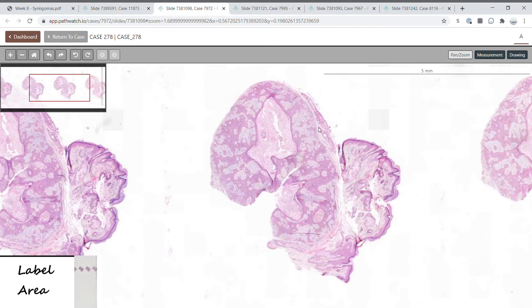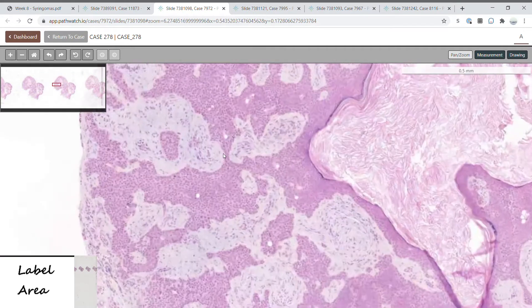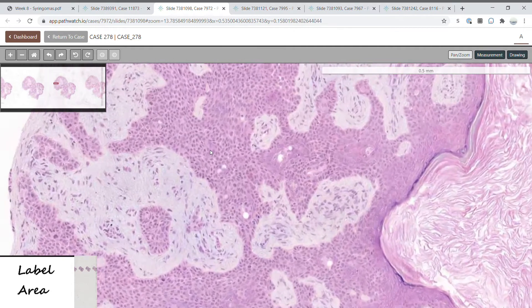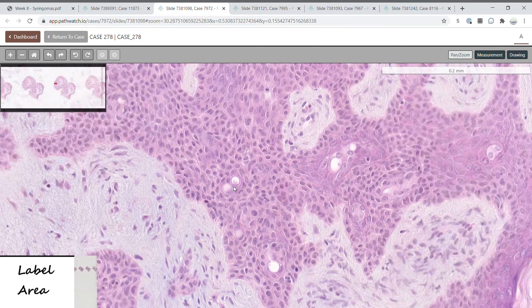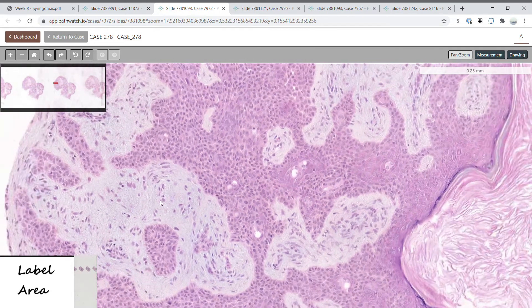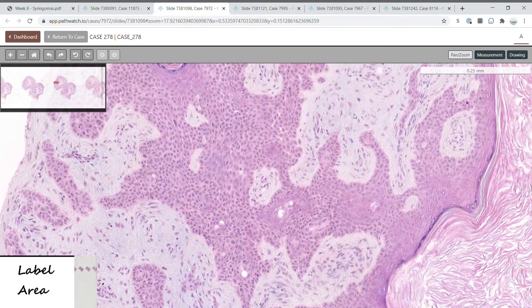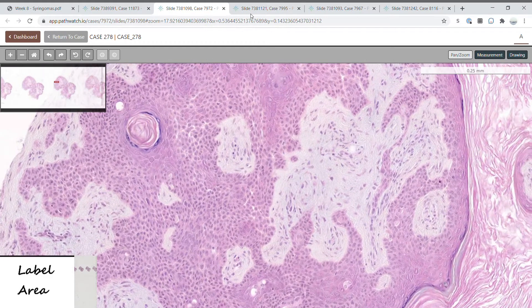This is one form of a mixed tumor, also known as chondroid syringoma. There is a proliferation of epithelium — which is eccrine with cuticle formation — as well as stroma. Here you can see myxoid stroma with fibroblasts.